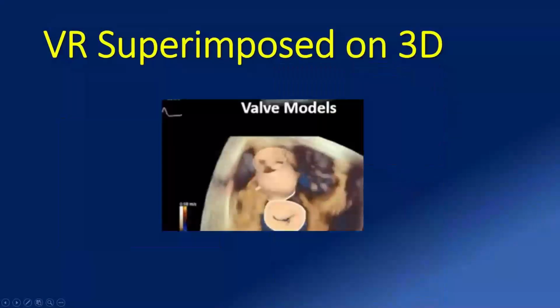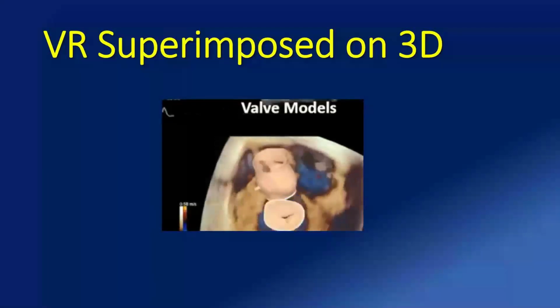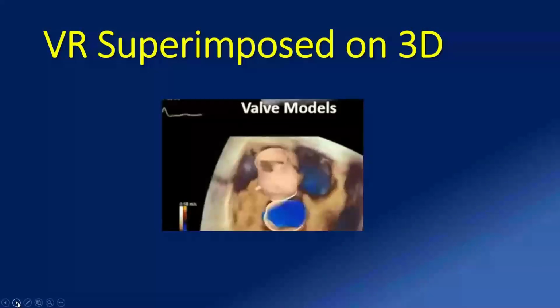And of course, we can also superimpose virtual reality on 3D models to better understand the interaction of different structures and the morphology.